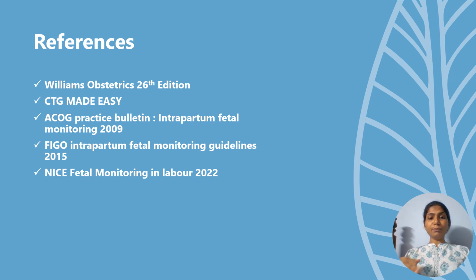This is very important to prevent fetal asphyxia and hypoxia, but we should not be in a hurry to make our decision only based on CTG, because present consensus has told that increased use of CTG might lead to an increase in cesarean section rate and operative delivery rate, but it does not reflect a decrease in perinatal morbidity and mortality.